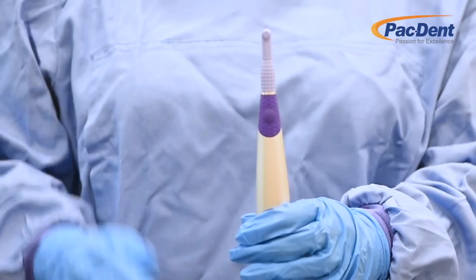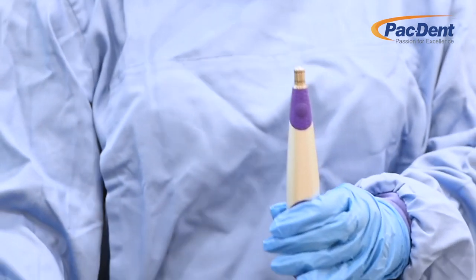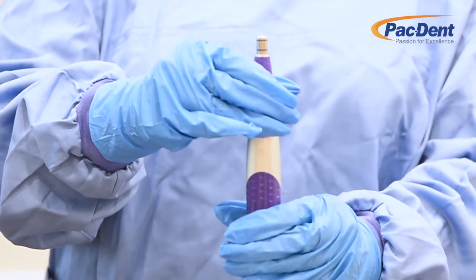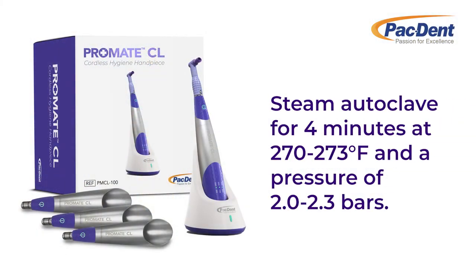The sheath must be autoclaved after each use. Remove the disposable profi angle and then remove the sheath to autoclave. Place the sheath in an autoclavable bag and steam autoclave for at least four minutes at a temperature of 270 to 273 degrees Fahrenheit and a pressure of 2.0 to 2.3 bars. Do not exceed a temperature above 280 degrees Fahrenheit or exceed 20 minutes.